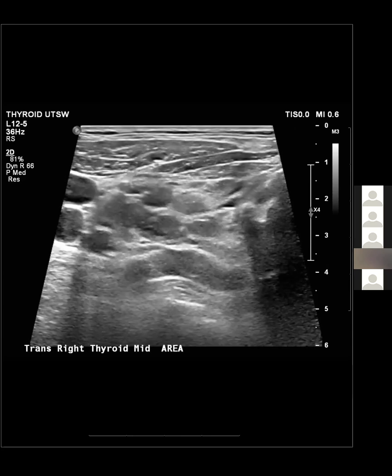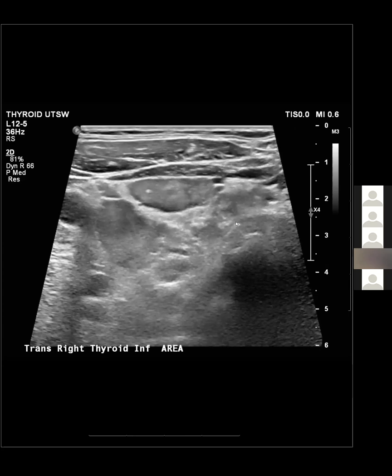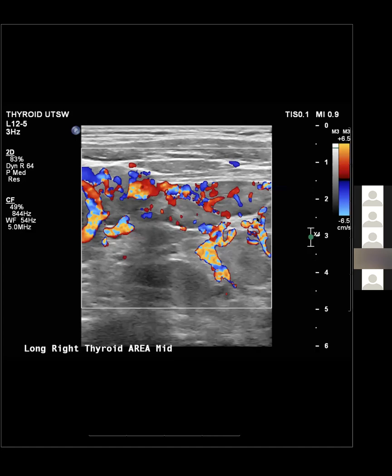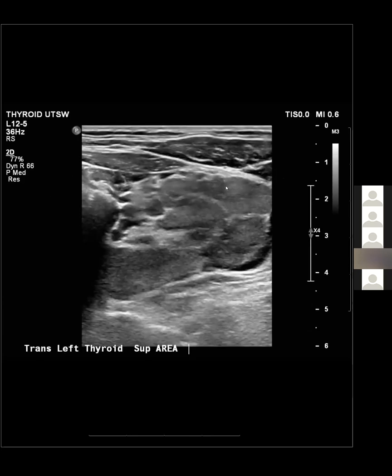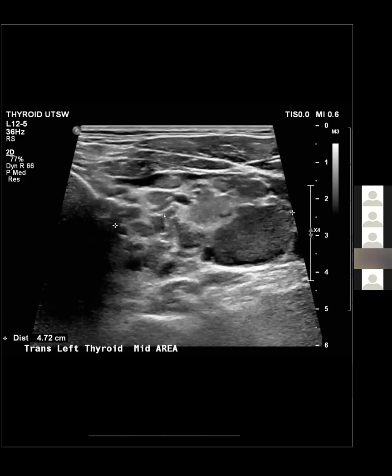So this is a similar patient, actually an older patient, a 62-year-old male, diagnosed with Cowden's syndrome by identifying the characteristic PTEN tumor suppressor gene mutation, and had a palpable goiter. And this is what their thyroid looked like. Oftentimes when we see thyroids like this, they're going to be associated with Hashimoto's. But this was huge, with multiple similar appearing isoechoic homogeneous nodules, and the thyroid is almost carved up into these nodules by fibrous bands, as you can see, almost like a cirrhotic looking liver, with lots of calcifications.